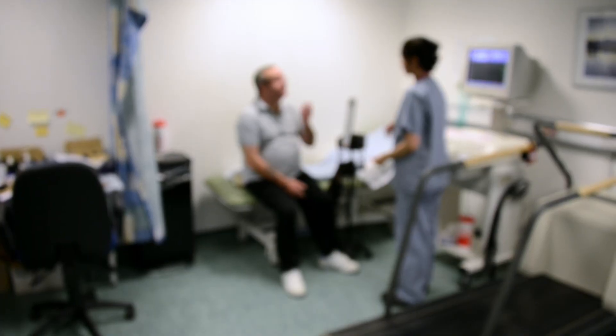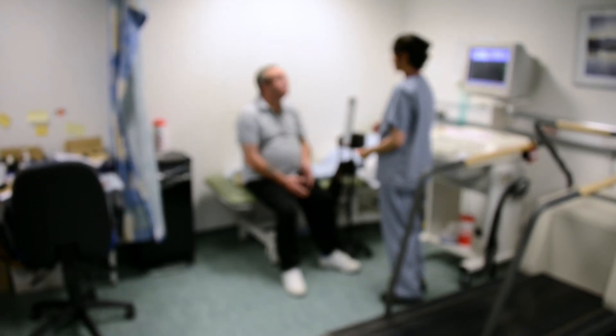My name is Parisha Khan and I'm a cardiac physiologist at St George's Hospital. An exercise ECG is basically a test to see how the heart performs when it's under stress. What we're looking at is the electrical activity of the heart and also blood pressure changes while a patient is walking on the treadmill.